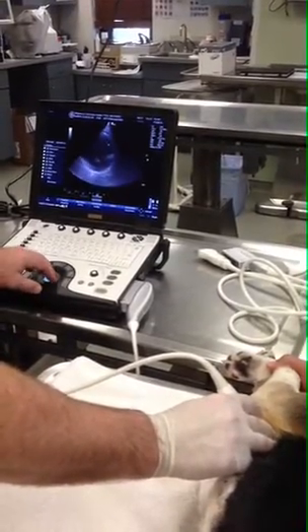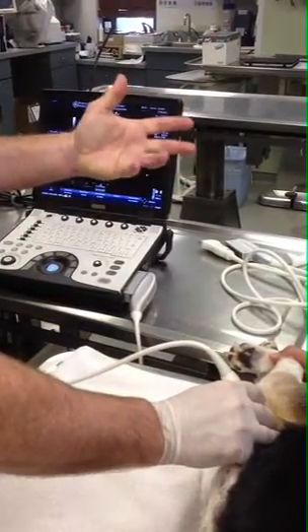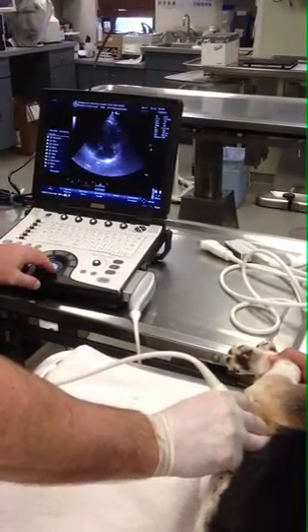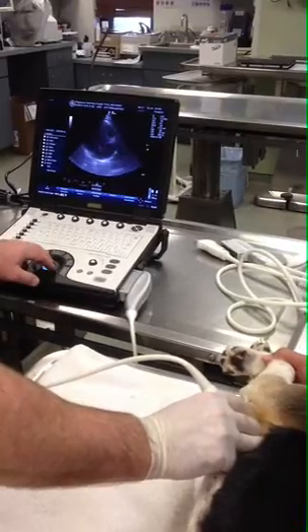I've got lung artifact coming in — I get a hazy image. So what I do is I take my last two fingers, my ring finger and my pinky finger, and I just push down on the lung, stay sternal. The dog's barely feeling the probe; he's feeling my fingers. And I just create my own window.